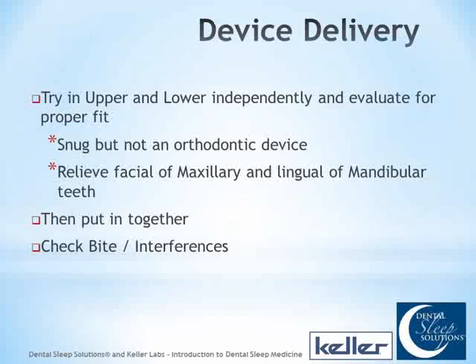So remember, we don't want these to be orthodontic devices. We want them to fit and fit snugly. We don't want their teeth to fall out from that. And make sure that, like Guy said, make sure that their bite's not off one way or the other, even when we put that in. With the tap, which just hits in the front, make sure that the posterior is not hitting. With the EMA, make sure that the pads that are built up in the back, when you bite your teeth together, I want it hitting exactly the same on each side.